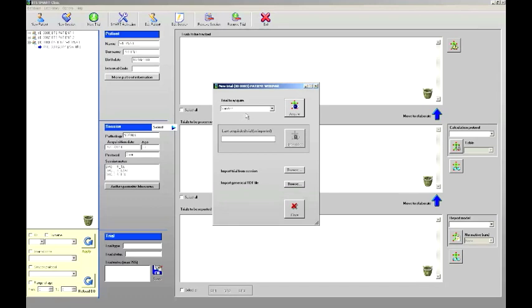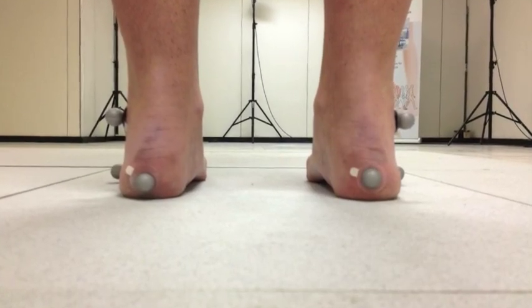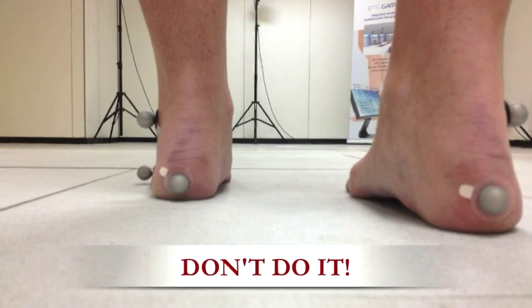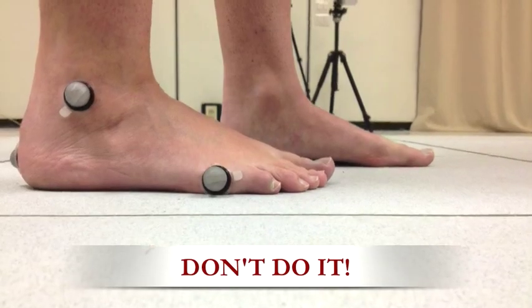This trial is important for many reasons. First of all, for a technical reason, because it's used by the protocol to compute some values necessary for the dynamic trials. Pay attention to have your patient with the two heels well aligned. Ask the patient to not keep one foot in front of the other one.